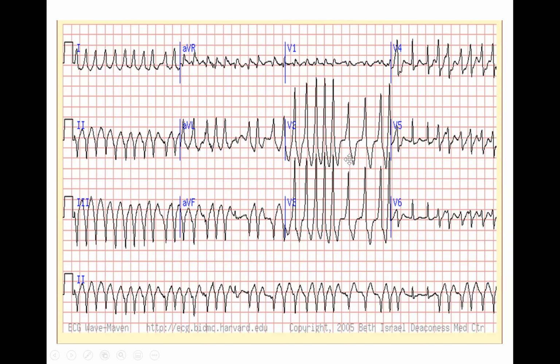Thank you all. You can close the mics. You did very well. Okay, so it's a very wide QRS. It's the hallmark. It's very irregular. Of course any VT in general, 90% of VTs at the beginning, in the first 30 seconds, usually they are irregular and they organize later on. So a VT can appear like this. But what is unique about this ECG is the variable RR and the variable QRS duration.